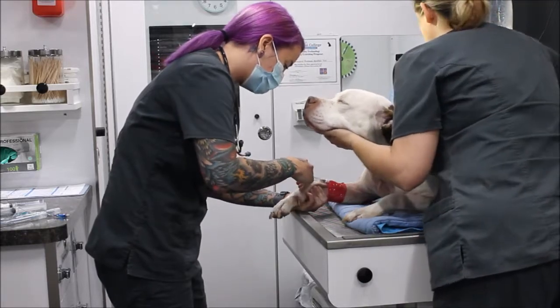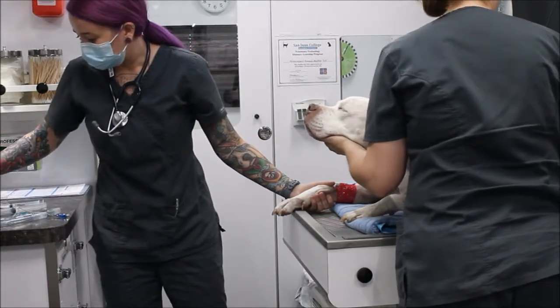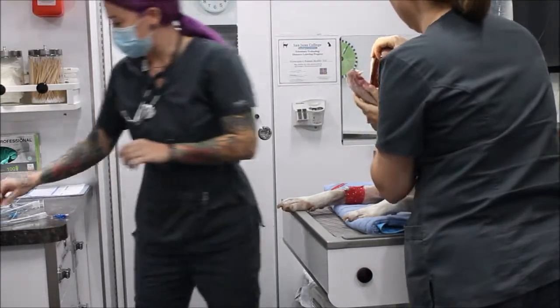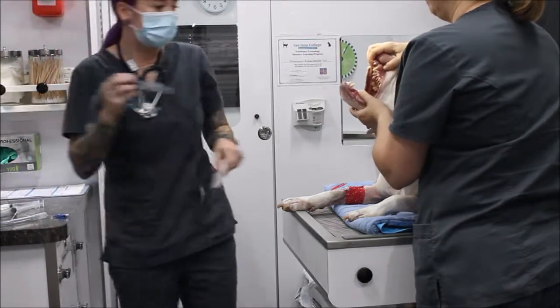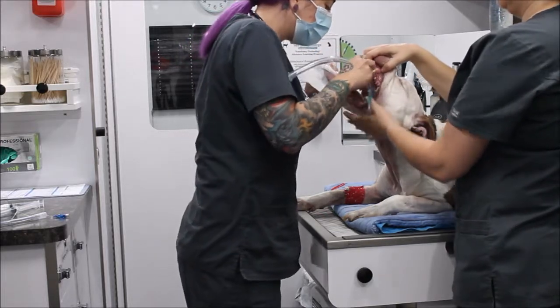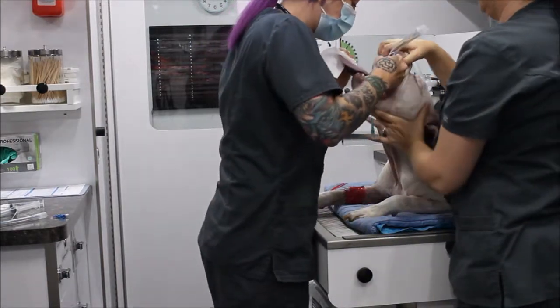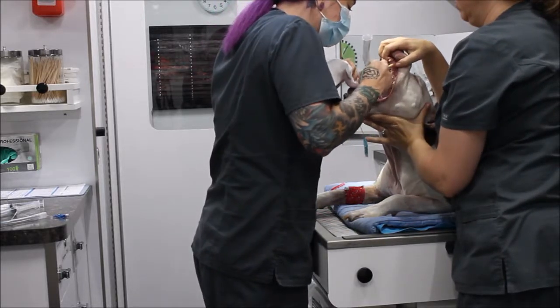I have confirmed that I have all of my items I needed beforehand. I have my endotracheal tubes, which I have checked for leaks. Checking his jaw tone now. I have my endotracheal tube with just a little bit of sterile lubricant on the end. I'm going to visualize — pushing the soft palate up with the tube and the epiglottis down.